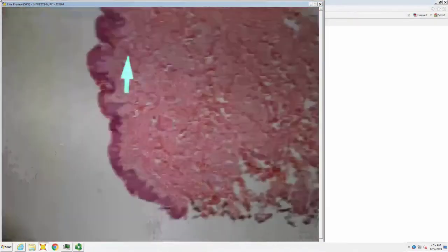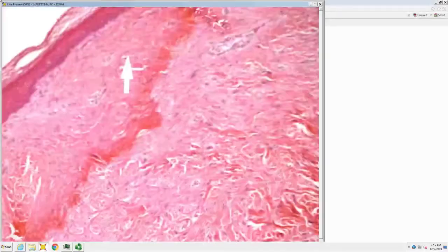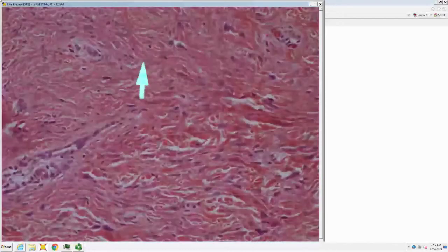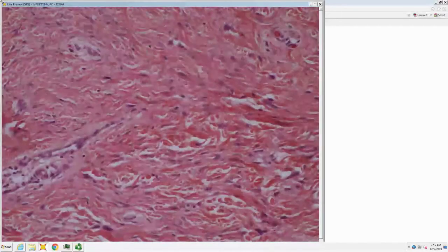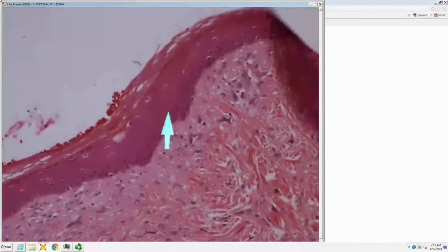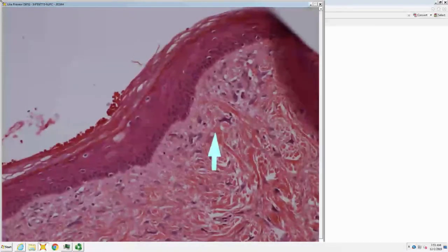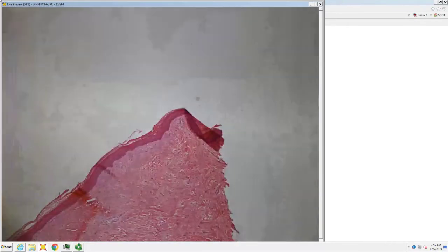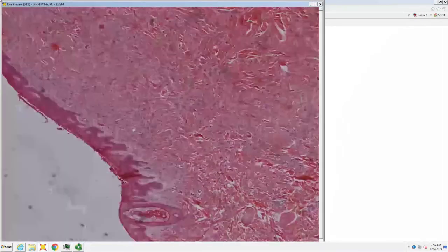Fairly hypocellular, but when you look at the cells that are there, they are these large, somewhat stellate gray fibroblasts that look like radiation fibroblasts. Pleomorphic fibroma. So pleomorphic fibroma, hypocellular, large stellate, radiation type fibroblasts.